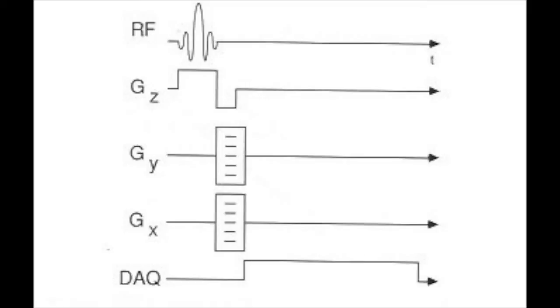And for CSI, chemical shift imaging, a larger volume selection occurs, of course, and it can be 2D imaging or 3D imaging. If it is 2D imaging, selective excitation must be provided at the beginning. We are combining spatial localization with spectroscopy.